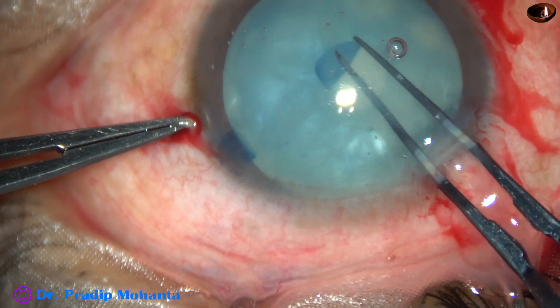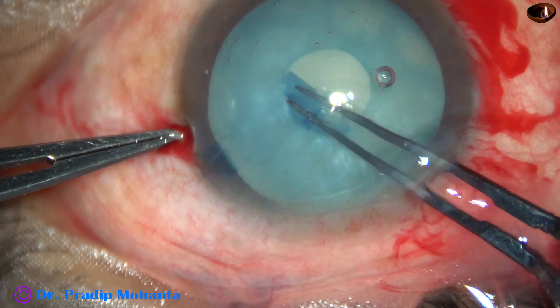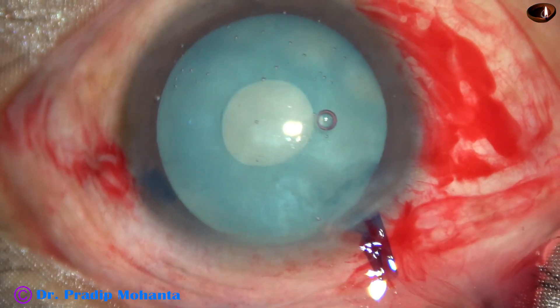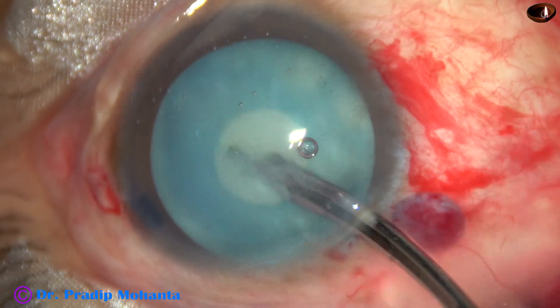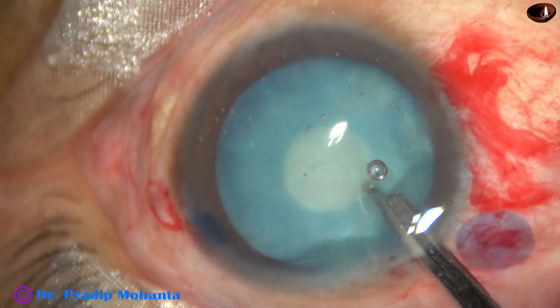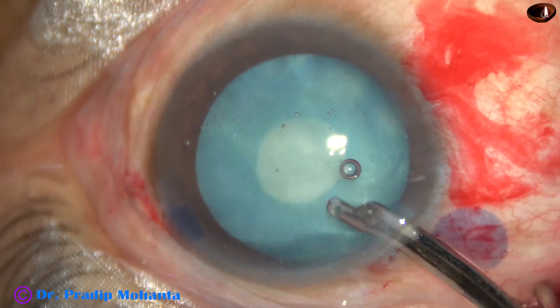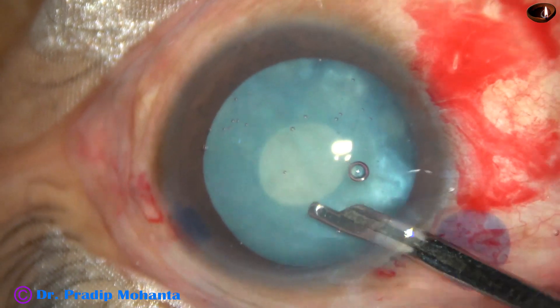Immediately the flap is rotated to convert it into a C-flap. This C-flap is guided in such a way that it becomes a small rhexis — a mini-rhexis. This mini-rhexis can tolerate some stress while removing the cortex through this small opening. A 23-gauge Simcoe cannula is being used to remove the cortical lens matter, and a lot of cortex comes out. The bag becomes decompressed.